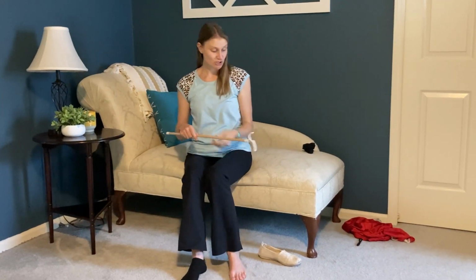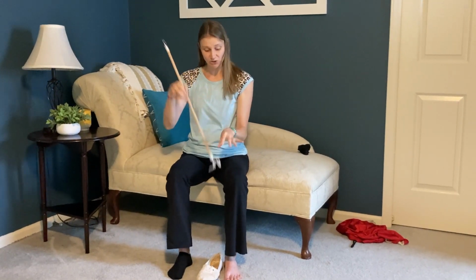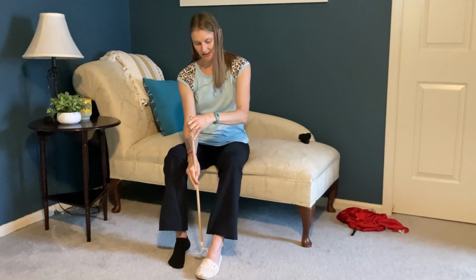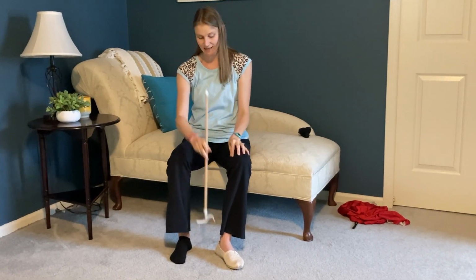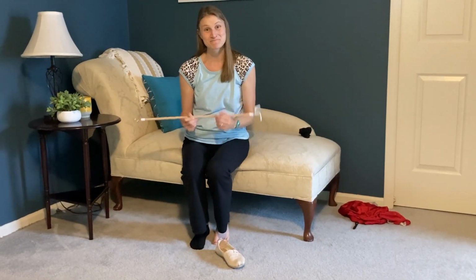If you can't find your shoehorn, you can bring your shoe around. And again, with this downward facing hook, I can use that to hold the back of my shoe in place while I slide my foot into the shoe to get it thoroughly on. I can also use that to take my shoe off. I'm using the same technique. So I'm going to take that downward hook, run that into the back of my shoe, and give some downward pressure to help me take my shoe off.